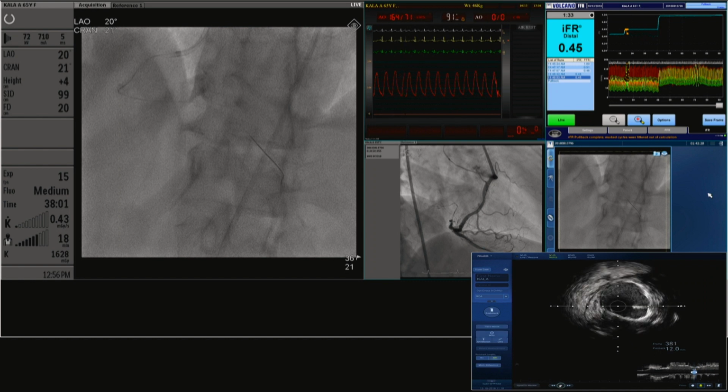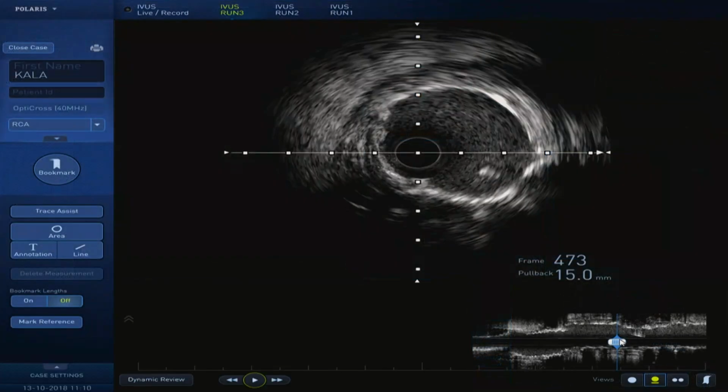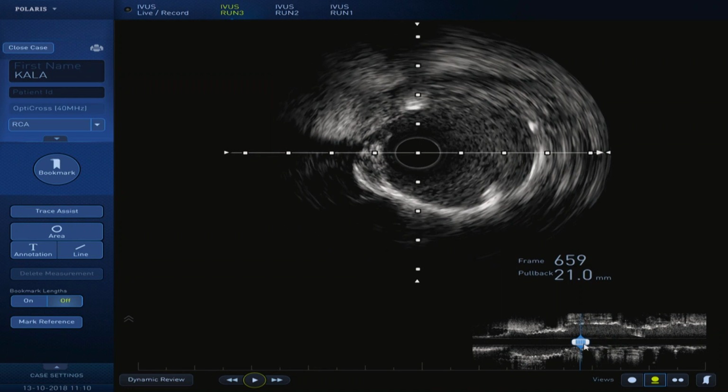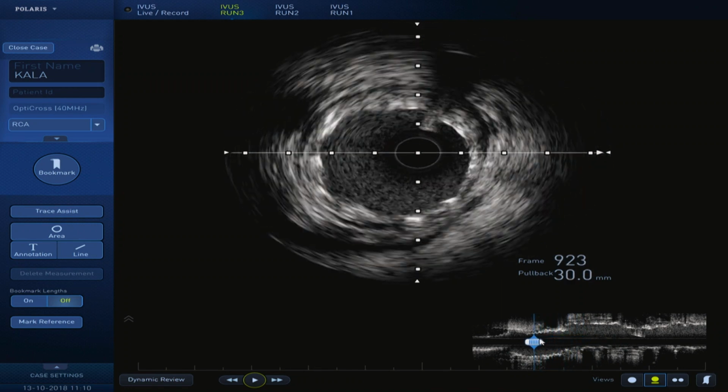Yeah, I agree, Pratap. Once I decided to stent the proximal, the issue was short or long. It didn't make a difference. And if you saw the IVUS, yes, criticality of the disease was focal. But if you see the good to the good, it was pretty long, about 30 millimeters. So that's why I took the 38 and brought that down.